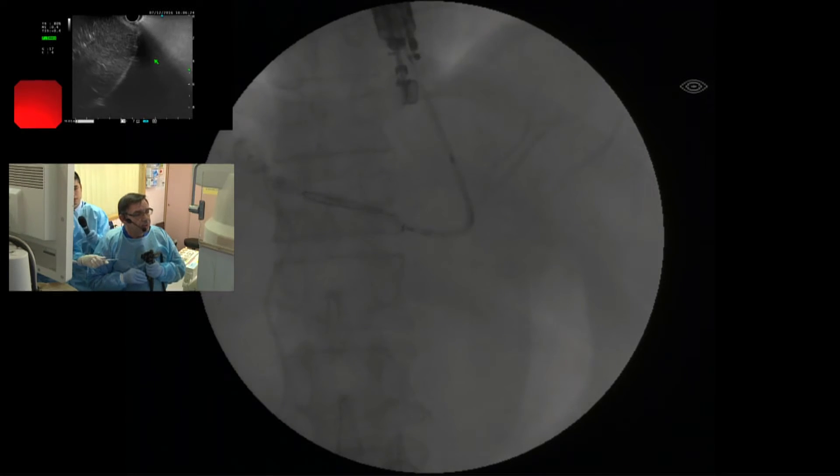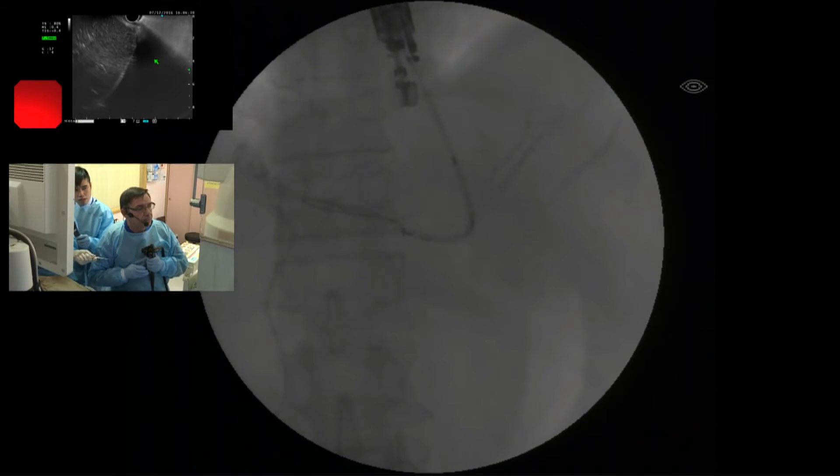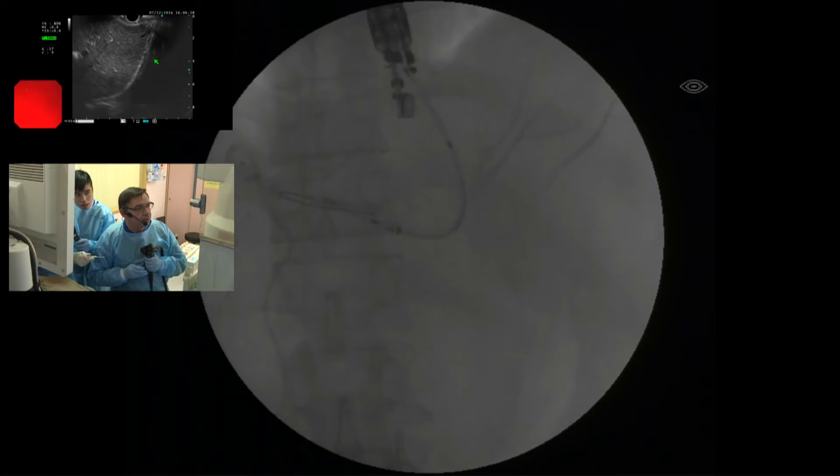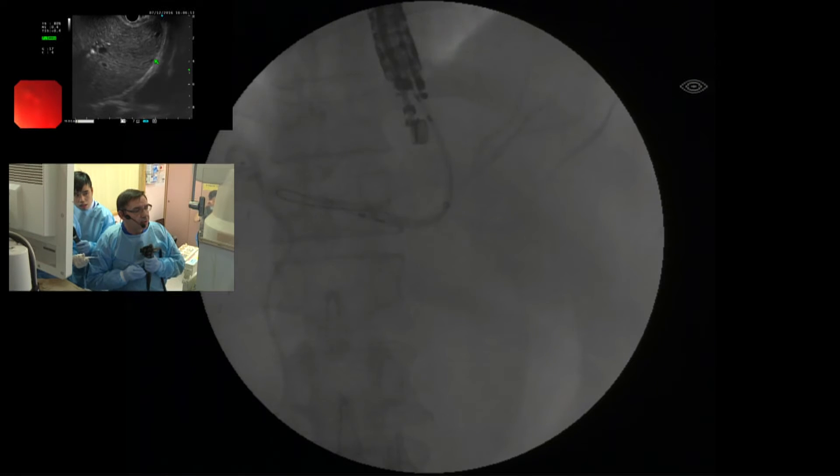Open, open, open — no problem, open. When you arrive at the mark in the middle — this is the uncovered mark. Yeah. Okay, you can open now. Open, open, open — more, more, more. And now you stop — this is the halfway mark. Yes, now I will move to the endoscopy image to check and make sure the stent is in the stomach.